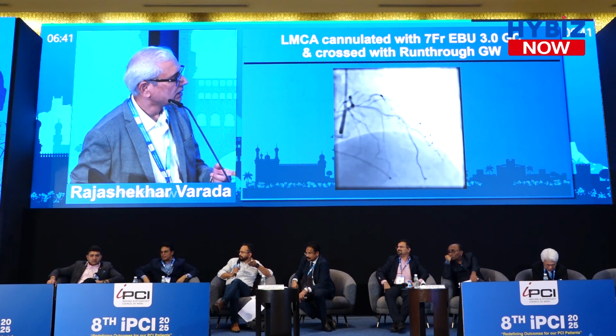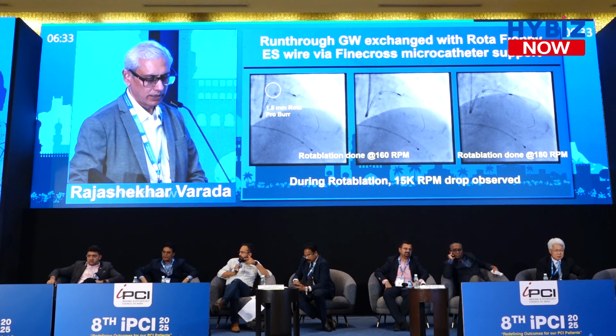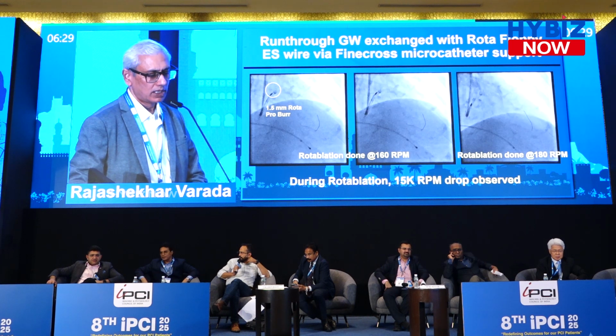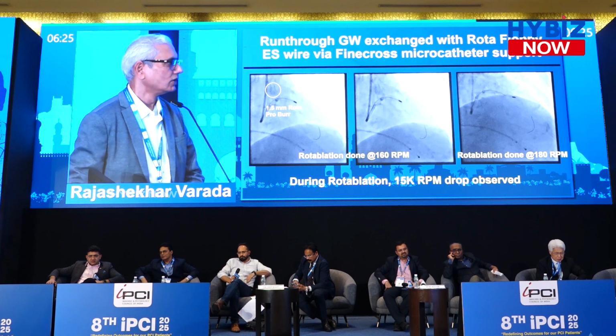But I think you are showing another case also. Do you have time? A little bit fast. Can we use a 1.5 millimeter burr? Here, rota will be excellent because there is a nodule sitting on the ostium actually. Yeah. So I hope rota will be the appropriate choice for this lesion.